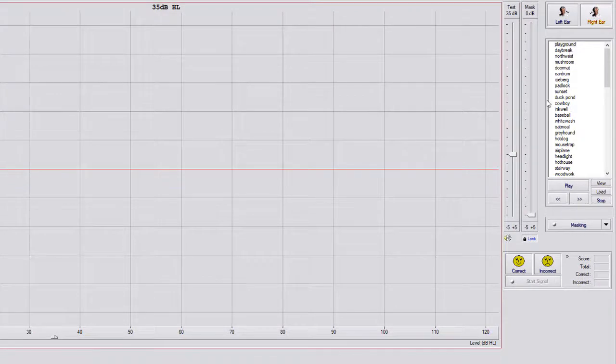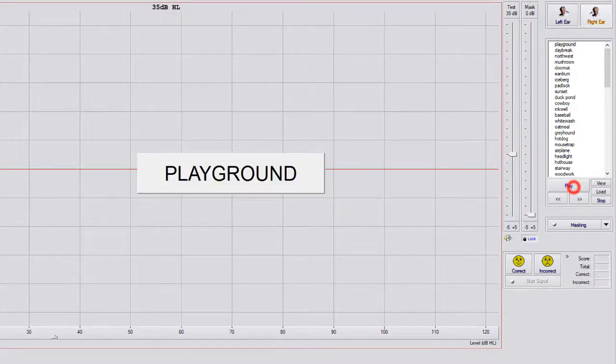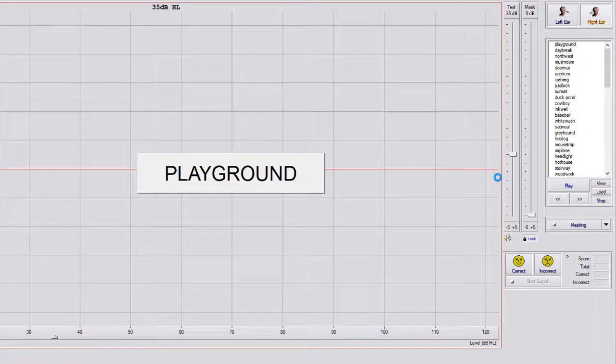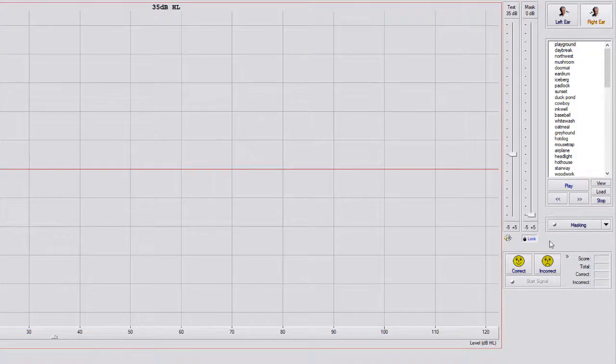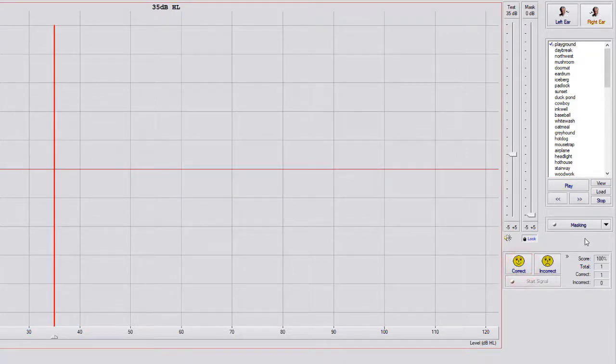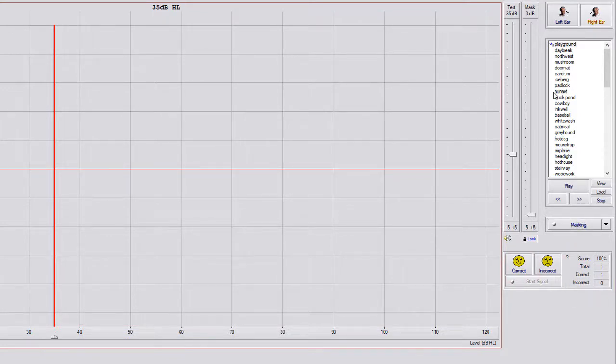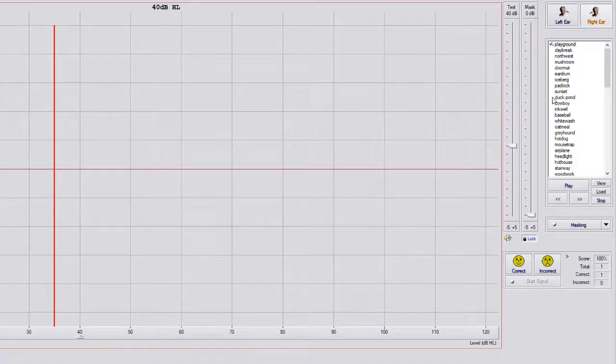To start this, you're going to hit Play, and it's going to say the word Playground. You're going to hit the happy or smile on the face or correct or incorrect, and it's going to score everything here for you, and then you'll make your adjustments. So they got that correct. You make your change, and then you'll hit the next button or the next chevrons here.